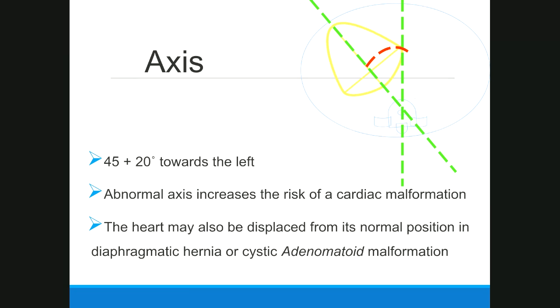So this is an example, a line drawing showing this transverse view through the thoracic cavity with our 4-chamber heart here. So this is our spine back here, and this is our anterior chest wall. Because of what we just talked about, we know that this should be the right ventricle of the heart. This should be the left atrium, because it's closest to the spine, and the right ventricle is closer to the anterior chest wall.